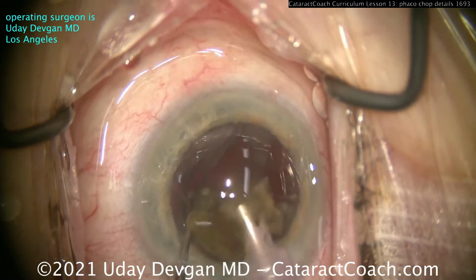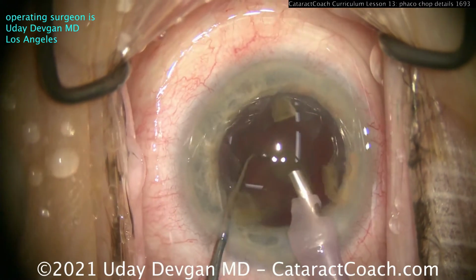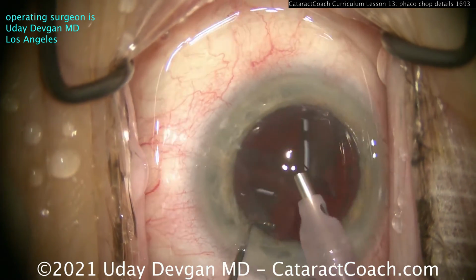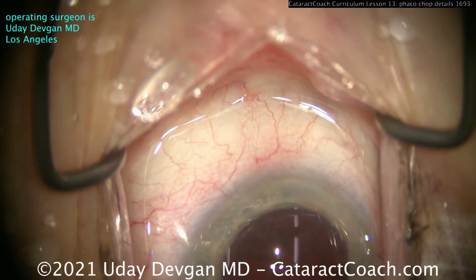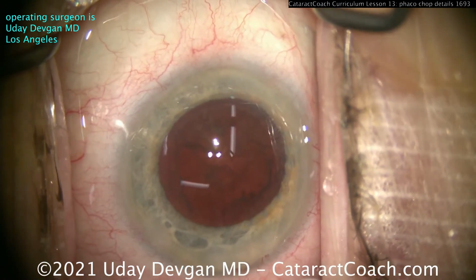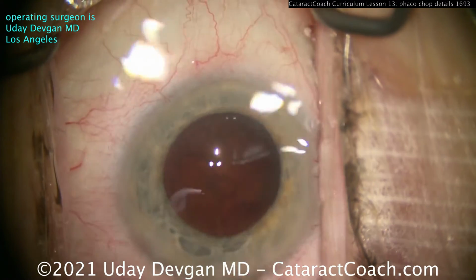So when you have a patient with more nuclear density, that means more chops. You saw the previous video we put just before this. I think it was video number 1108. In that video, we say, if it's moderate nuclear density, then just one single chop is all you need. But in this patient, where there's more nuclear density, you need multiple chops.